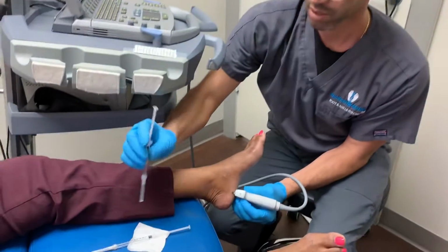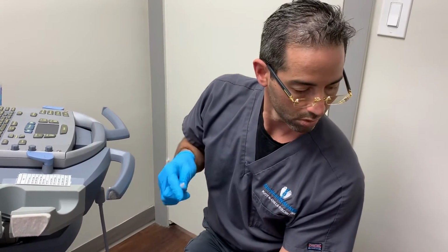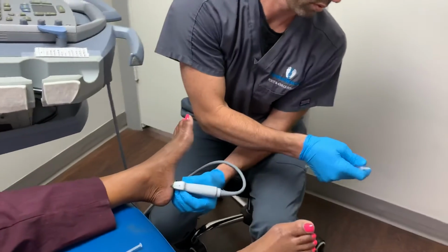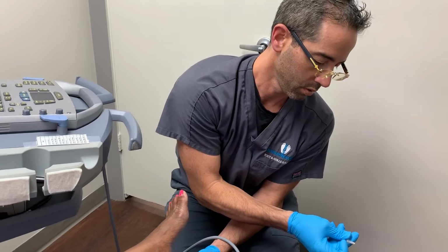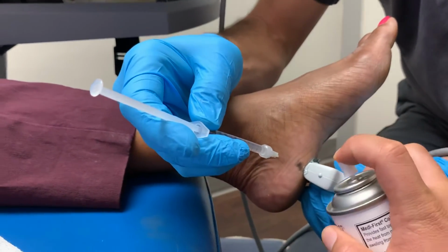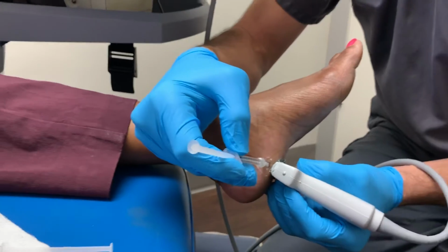Okay. Pop goes the weasel. Okay. 1 second here. Here we go. You're gonna feel a little stick. The only thing I ask is please do not move your heel. Okay, and we look at the ultrasound, we're in the right spot.